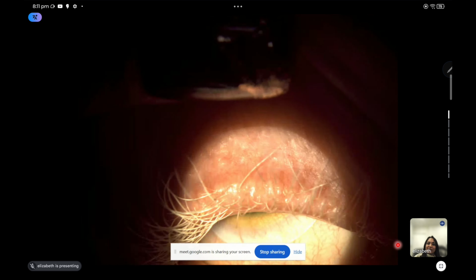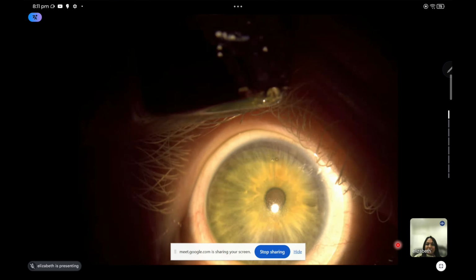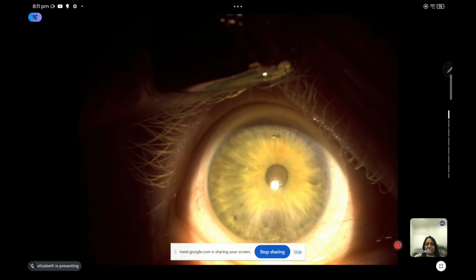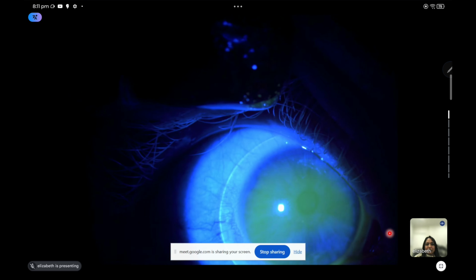You can see there's a lot more movement. Also, keratoconic patients and patients with albinism are very photophobic. So apologies for the slit lamp image not being great, but I did try to hold his lid up there just to show you what kind of movement we get. And that tear exchange, you can see the tear exchange under the lens with the bubbles moving across.